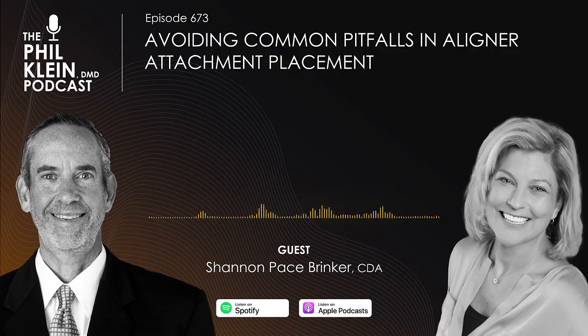Phil, I love that. I'm going to tell you, there's a lot of speakers out there, my mentors, that, again, feel the same way about the template. But I hear a lot of these mentors telling dentists that they can cut this down the midline, or even poke holes in it. I'm like, what are you doing? You can't tell people this stuff. I've heard it all. I feel that when we start altering that template, this is where we start making mistakes.